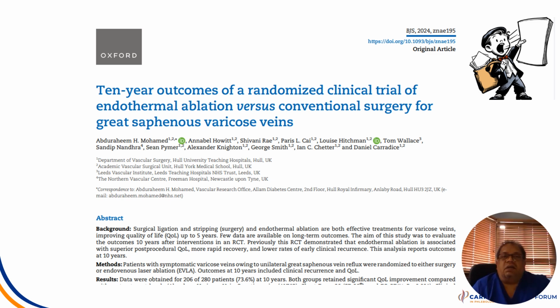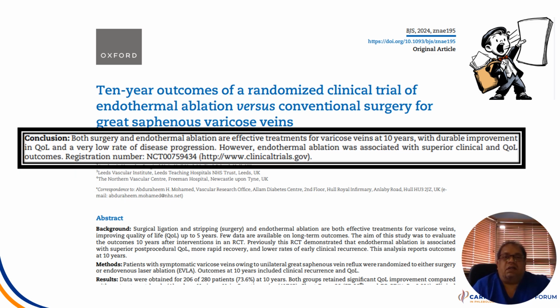More recently is this large series which states clearly that both surgery and endothermal ablation are effective treatments for varicose veins at 10 years, with durable improvement in quality of life and a very low rate of disease progression. However, endothermal ablation was associated with superior clinical and quality of life outcomes.